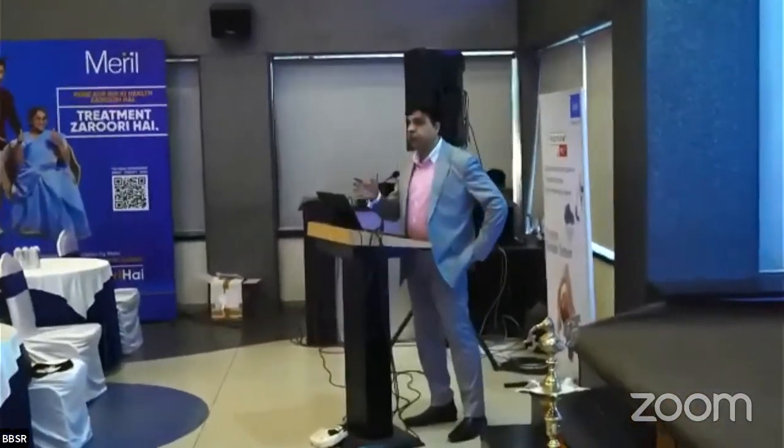So there was no choice of an articulating spacer. In this case, we went in with a static spacer, taking out those components. Now, when you try to use a distal femur replacement process, be it LPS or Edler or whatever you want to use, the problem again is the same. How do you match the size? That's a very big issue for a replacement prosthesis. That's the minimum size that you have, right?